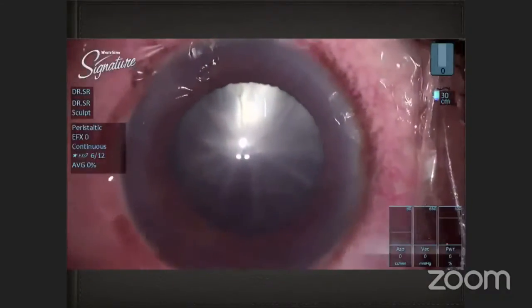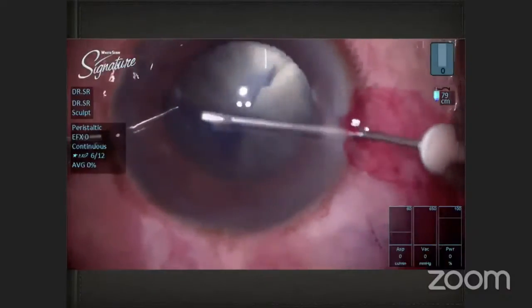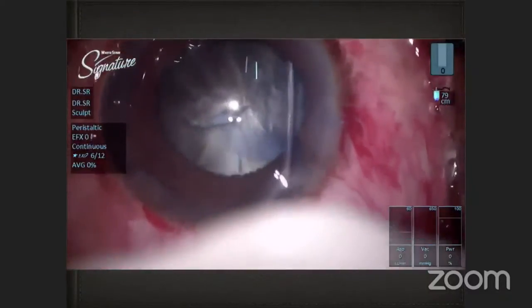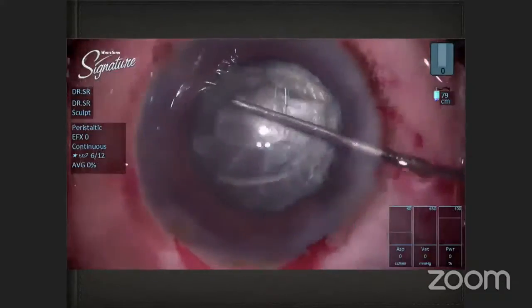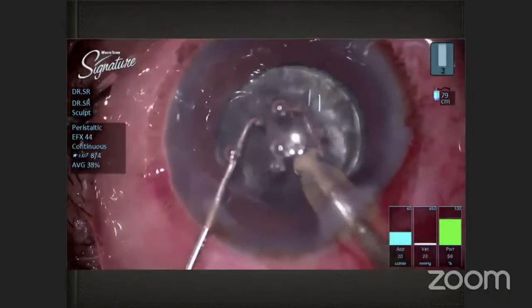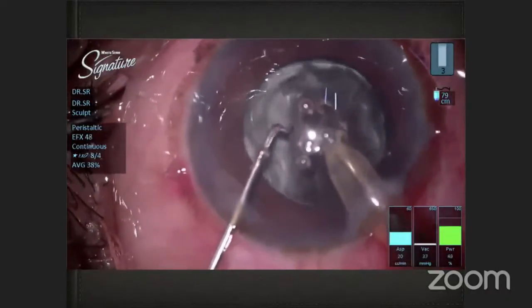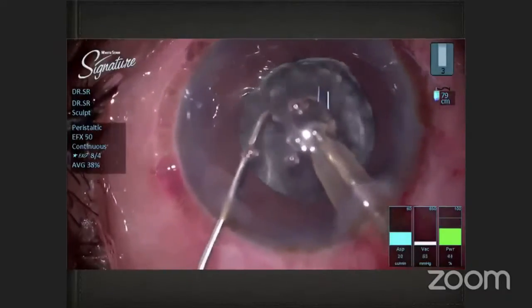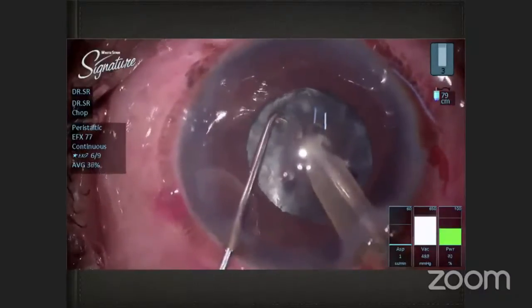Moving on to this next decidedly darker and blacker nucleus. The pupil is also slightly smaller in this case. I do a gentle multi-quadrant hydro, just summarizing the points which I mentioned in the earlier case, and ensure that I have a good rotation. Now here, as you can see, I'm making a really deep central crater so that I can embed as deep as possible so that I can crack the spine of this hard nucleus.